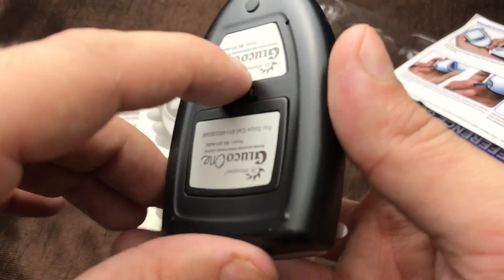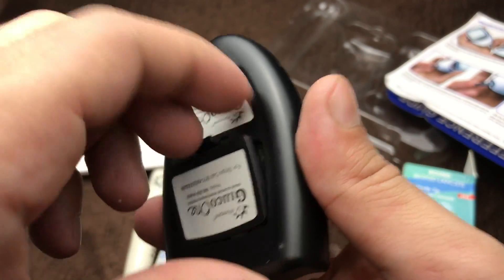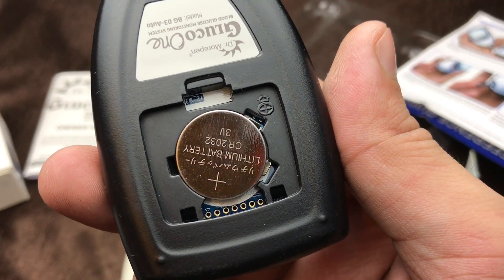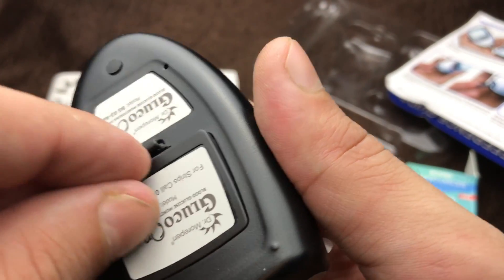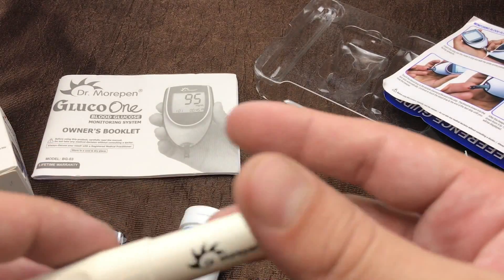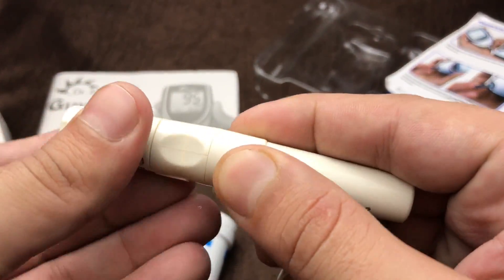Before using it, you have to put the batteries in like this. Now let's do a demo test. First, you have to make sure to change the needle. Let me show you.